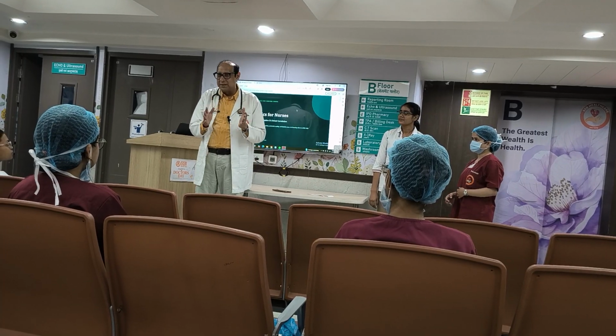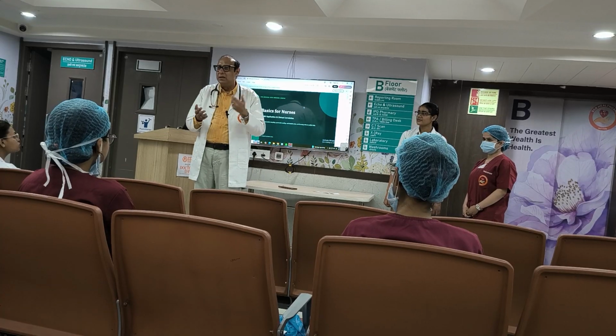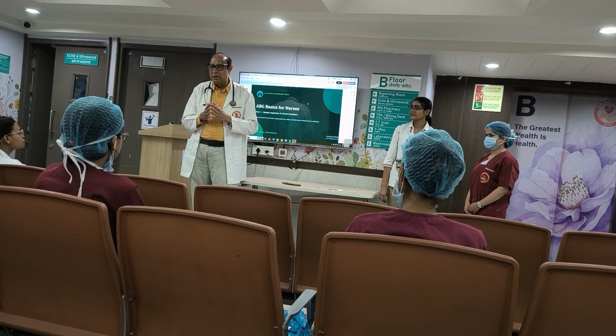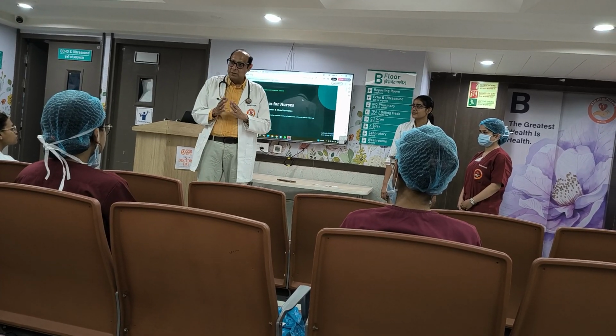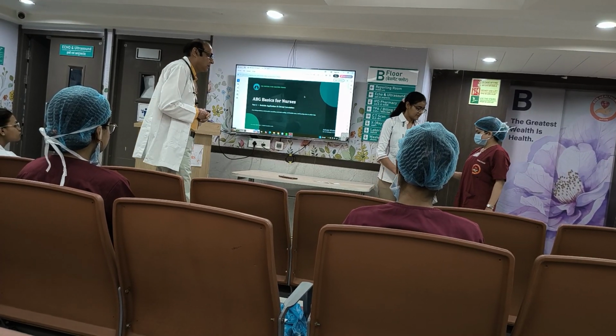First, you have to check the radial artery and ulnar artery, because with age, generally in ICU, adult and geriatric patients have atherosclerosis and fragile arteries when we are drawing blood. So you have to check the patency of how much blood flow is there. Now the sister is going to perform the Allen test.